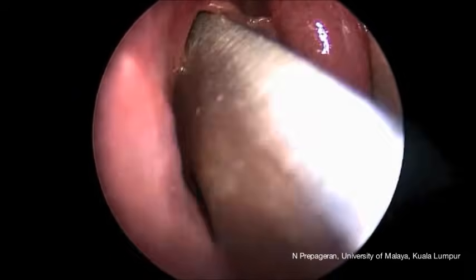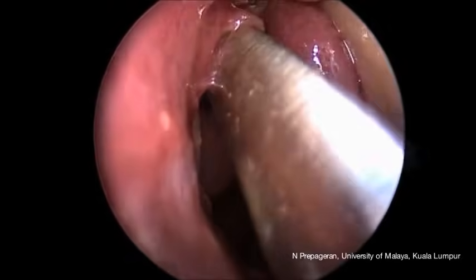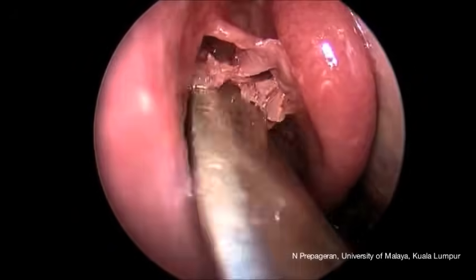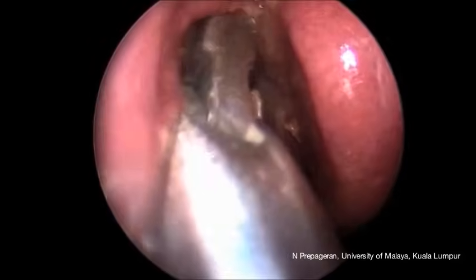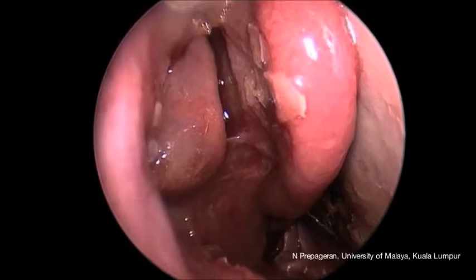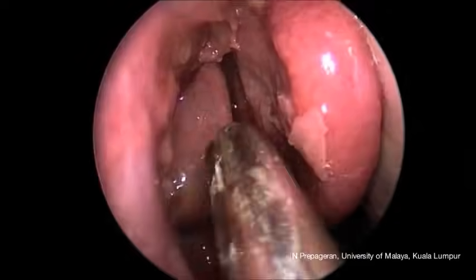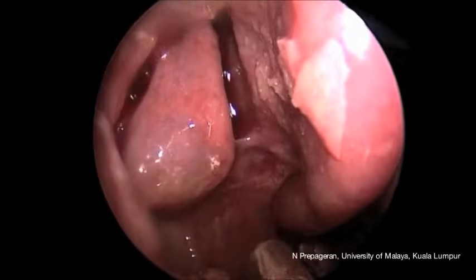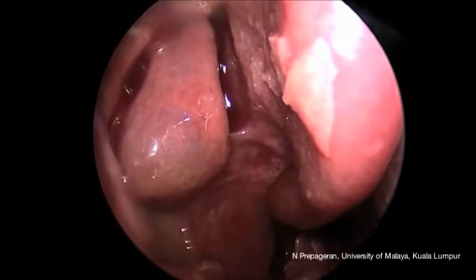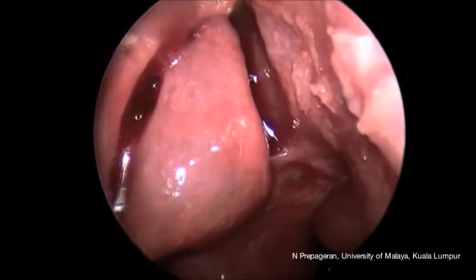We're going to dissect the uncinate process blind sac all the way to the top. This is a bit more tedious now simply because we removed the bone initially to show the anatomy of the uncinate process. We push the entire uncinate process sac to the very top and use through-cutting forceps to remove it. Now let's do a total ethmoidectomy. We've already removed the uncinate process and can visualize the bulla — very clear once the uncinate process has been removed. This is gate number two, the uncinate being gate number one.